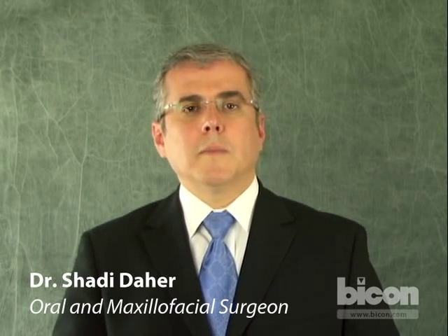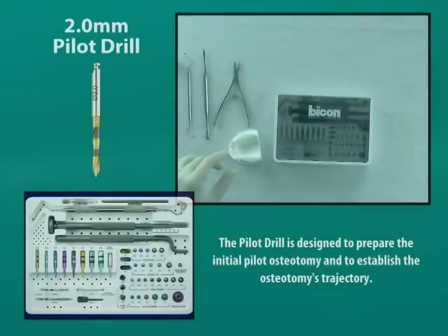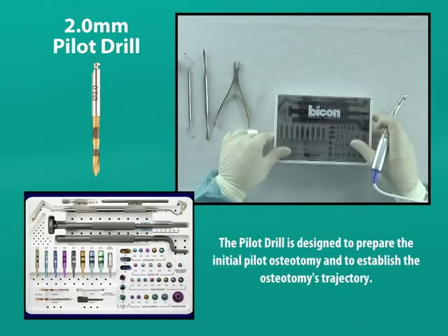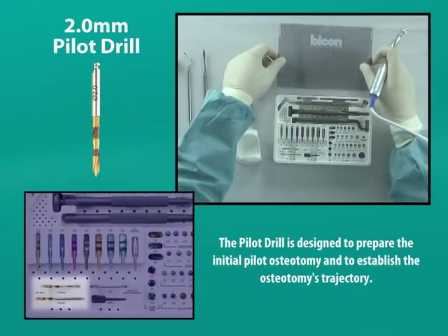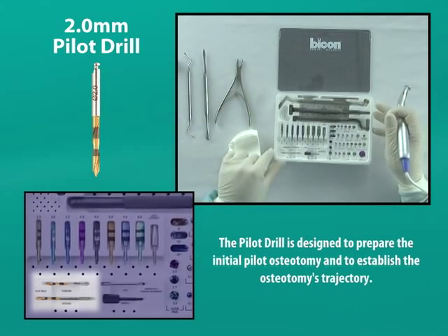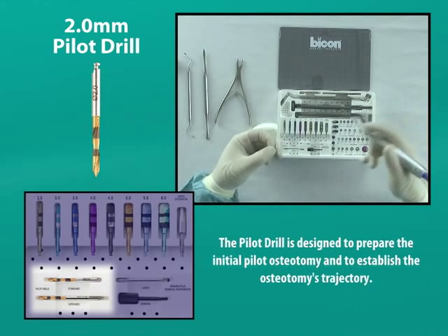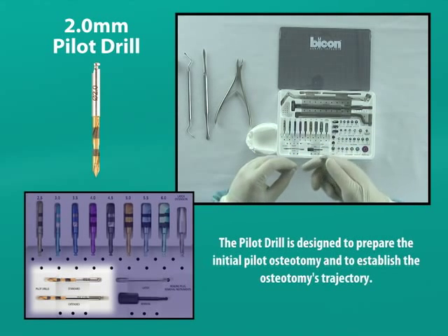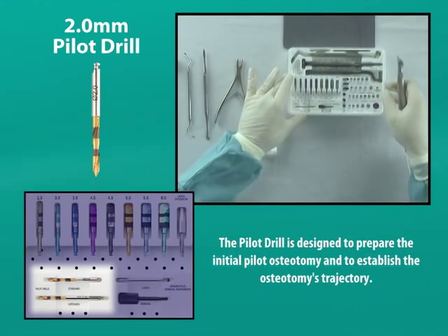During this demonstration, we will be placing an implant in the location of the maxillary left first molar. A two millimeter stainless steel pilot drill is usually the first surgical drill to be used. It is a two-fluted twist drill with a sharp point. The pilot drill is used with a 20 to 1 reduction handpiece or comparable handpiece rotating at approximately 1100 rpm. The pilot drill will be used to establish both the osteotomy's depth and angulation.